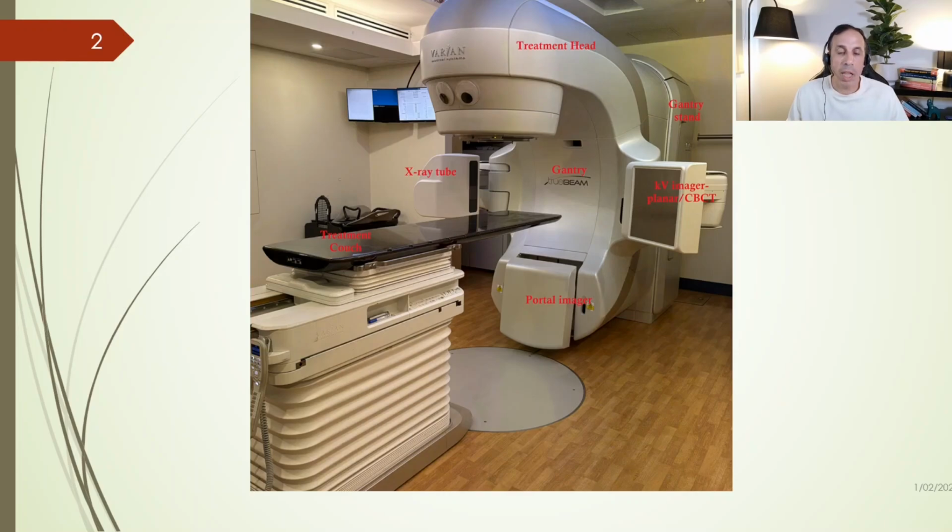This design helps deliver a high dose to the tumor while minimizing dose to nearby healthy tissues. As we know, it is the main aim of radiation therapy. The gantry is a mechanically heavy structure mainly because the treatment head contains a lot of metal components and extensive radiation shielding.